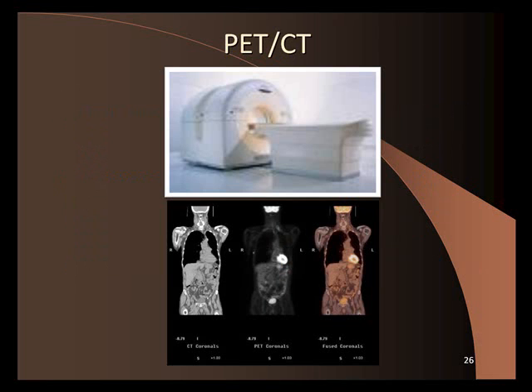It's all in the same unit. And here's the results you get. So this is a coronal. Remember what coronal is? Coronal is a cut in this direction. Axial is this direction, and sagittal is this direction. Okay, so this is a coronal cut of a body, reconstructed from a CT scan.